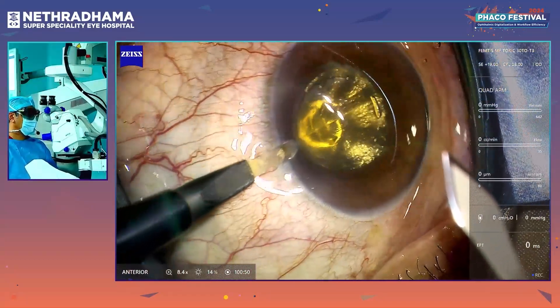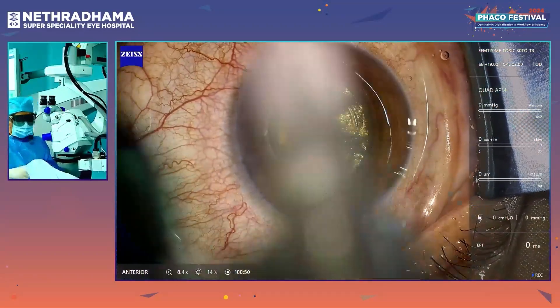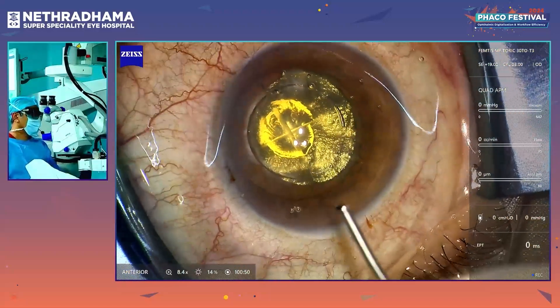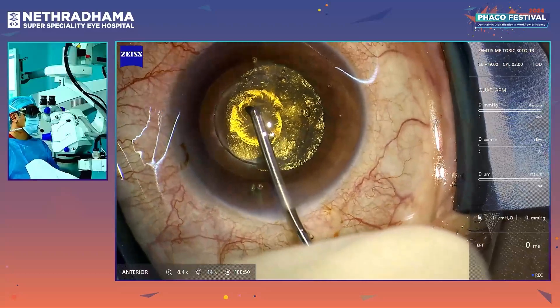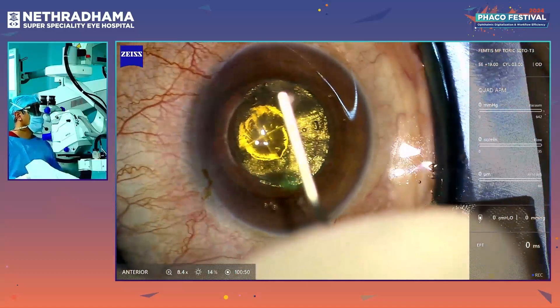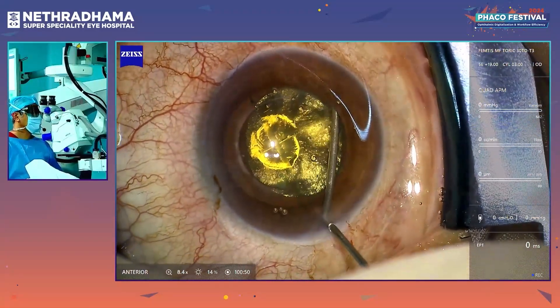I make my side port and this is a 2.8 mm incision. This patient has about 2.25 diopters of astigmatism. So this is a toric lens which we are going to implant — it is a 19 diopter FEMTIS MF with a T3 model, which corrects 3 diopters of cylinder at the IOL plane.